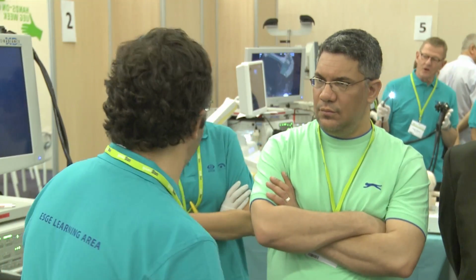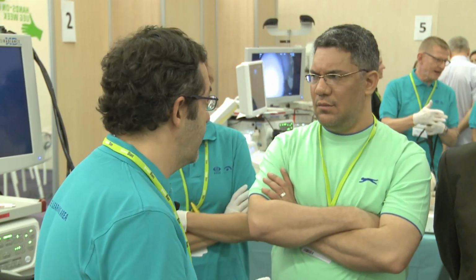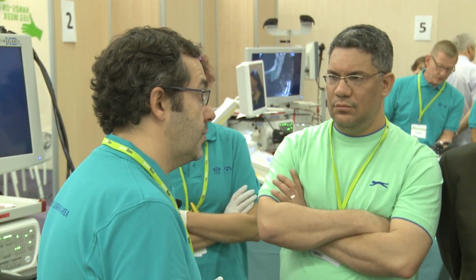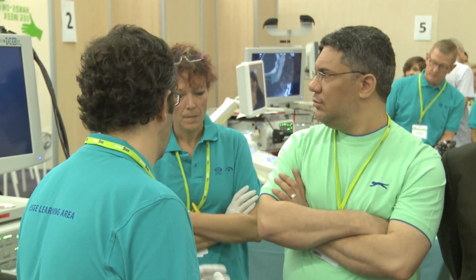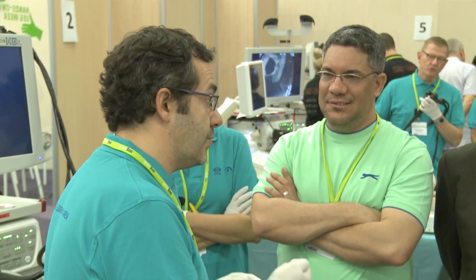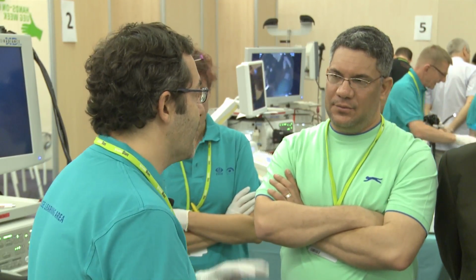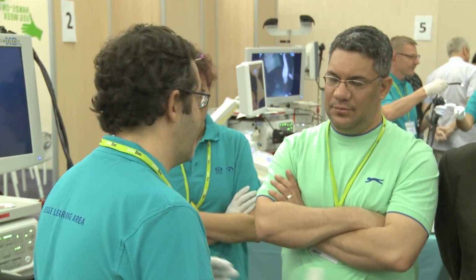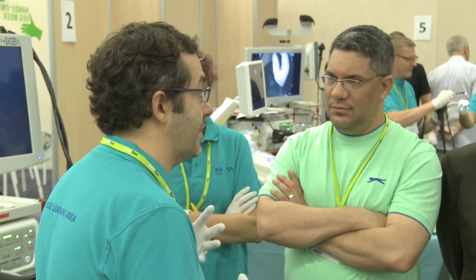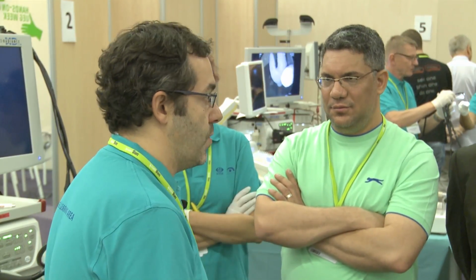We will work with Sonia, our nurse, who is a key part of the FNA. Okay, and I will show you how we work together with the nurse, mainly because we do not do deep sedation, we do not use propofol, we use midazolam and fentanyl. For me, the nurse has a key part in stabilizing the scope while you're doing the FNA, and sometimes the procedure can be done or not according to the expertise of your nurse, so it's equally important. Okay, so I will just show you how we work together, because this is a team. In all endoscopy, I think the nurse has a crucial part, and also in EUS.